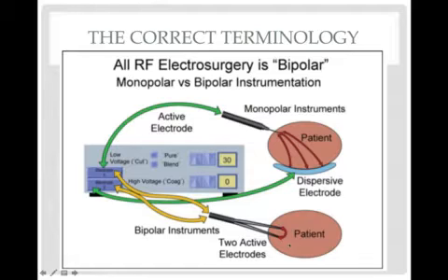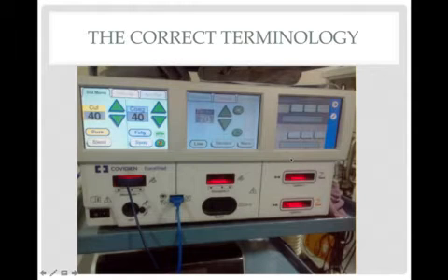So if we need a more confined area to apply diathermy, say for example if we have a patient with a pacemaker, we would opt to use, or it would be safer to use, bipolar instead of monopolar diathermy.